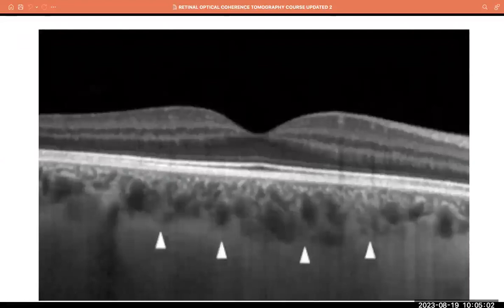Are there other questions? Yes, there's another question. Dr. Shemba is asking, can you go through the mnemonic on the layers of the OCT again? Many of us took the mnemonic trying to learn the layers of the retina, not actually the layers of the OCT. So the mnemonic is RPEOOIIGNI, and I'll explain it. R in the acronym is for the RPE itself.